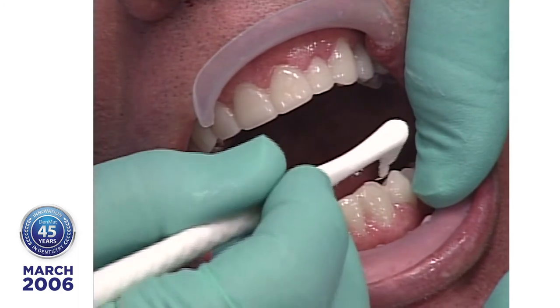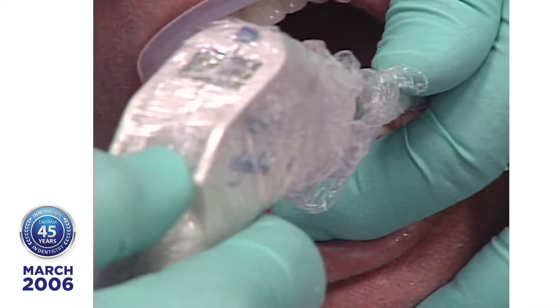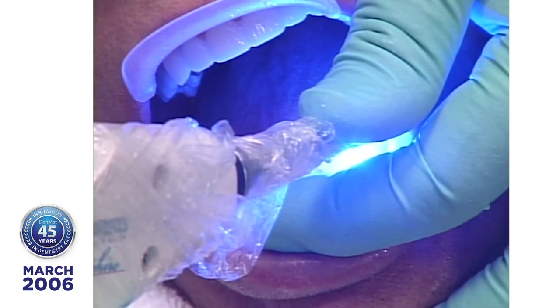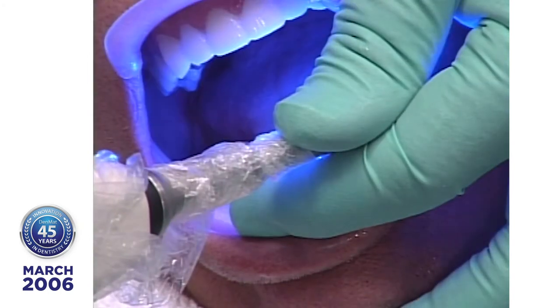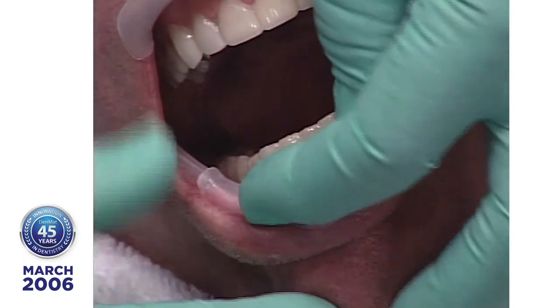And then I want to spot cure this down here. Hold still, close your eyes. And the reason I do the gingival is when I do the maxillary, I always do the incisal half.